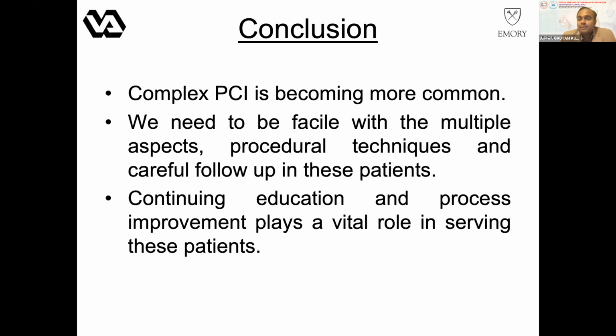Does going longer in terms of your stents carry a hazard of restenosis? Over the years, I've found myself in my practice doing what is called stent creep, where I notice my stents are getting longer and longer. I'm not sure whether that is correct, but when I first started, I used to say, oh yeah, there's the lesion, let's just put a 12 millimeter stent and cover it. Now, months go by that I don't even use a 12 millimeter stent. So I get your point, and I think that's a reality that we're working in.